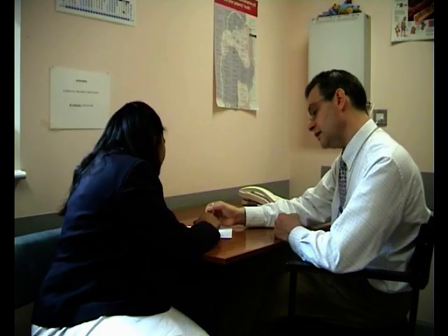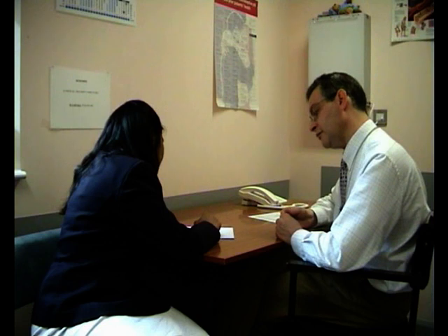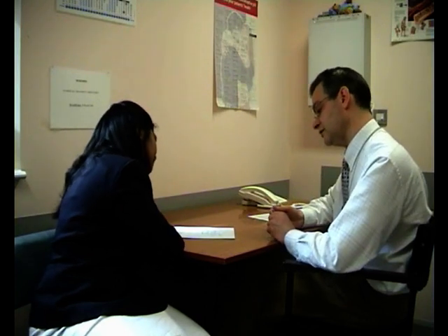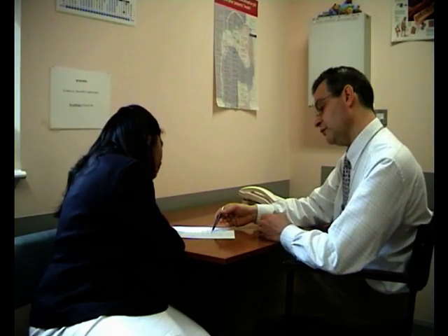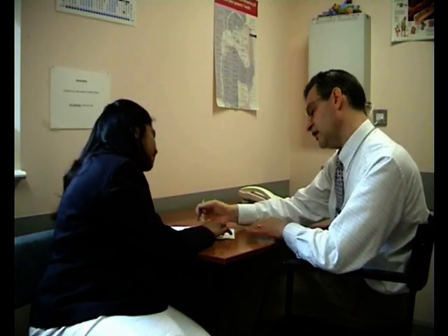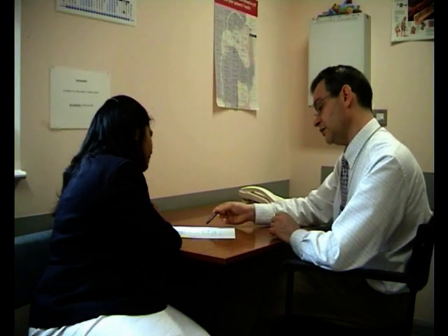Could you tell me what these lines are here? What do these lines represent on the detrusor pressure? What do you think might be happening at those points? It's an interference line. While the patient's doing what? Coughing or sneezing, that's right. So that is interference, as you say. And what's happened with the bladder pressure during that phase of the test? It has increased slightly, to 34 it seems. So more or less stayed as a straight line, as you say. Okay. And there aren't any annotations here of leaks or whatever. So as far as we can see, she didn't leak any urine during the course of this test.